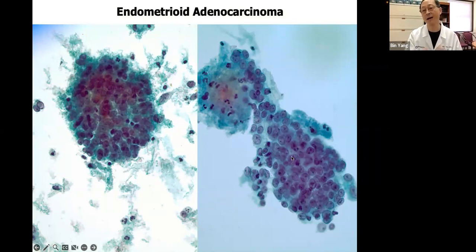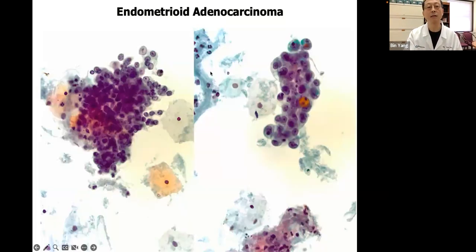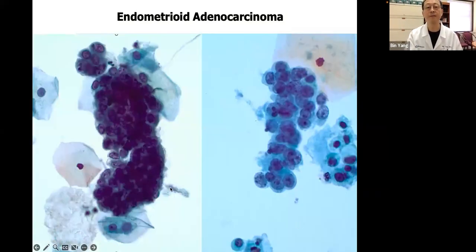And when you have this one, it's a challenge. Is this endocervical or endometrial? Sometimes it's not like a textbook. Another case: a 3D group, getting a little bit flatter than normal, but enlarged nuclei associated with tumor diathesis, 3D shape, and the borders relatively smooth compared to AIS.